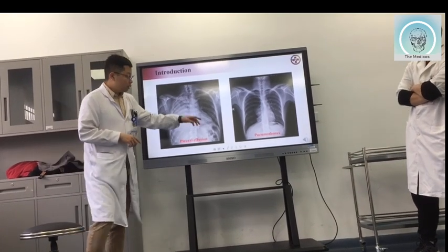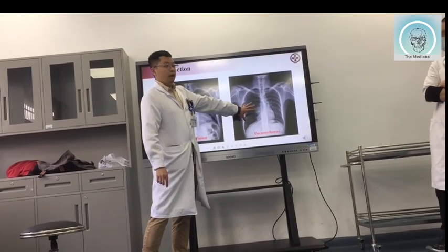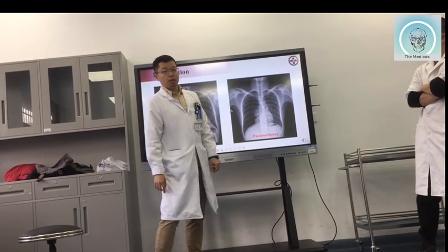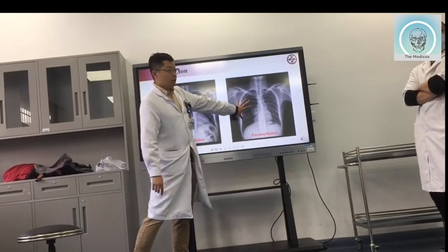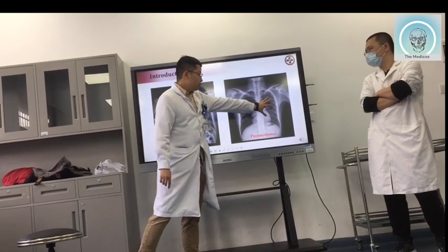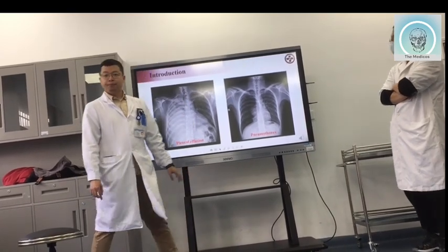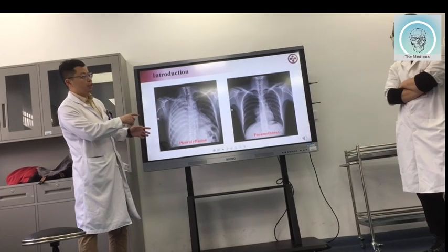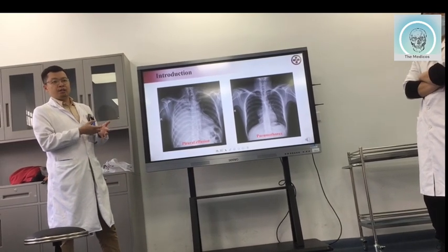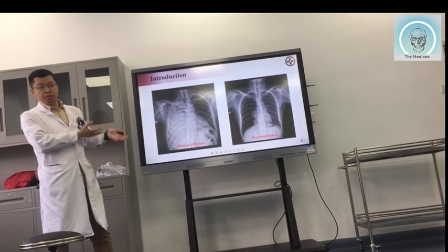Okay. And here, another kind of classic disease, pneumothorax. So here is all the air inside of the chest cavity, and the lung here has collapsed into this kind of area. Okay? This side is different from that side. You can see the lung here, the tissue, and here, these are all the air. So for this kind of patient, we usually do this kind of procedure to drain the gas, or drain the blood, or drain the fluid outside of the chest cavity to help the patient. Okay.